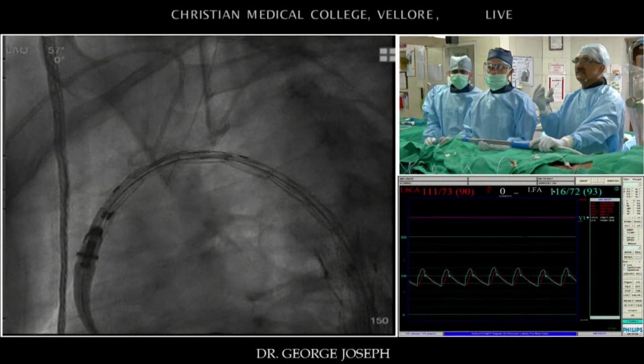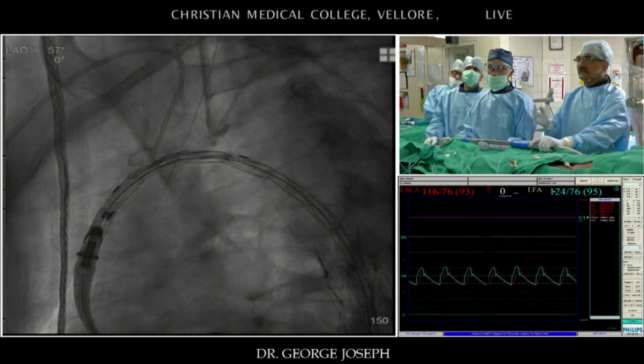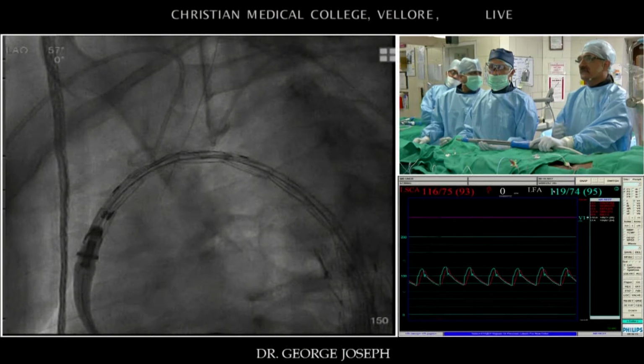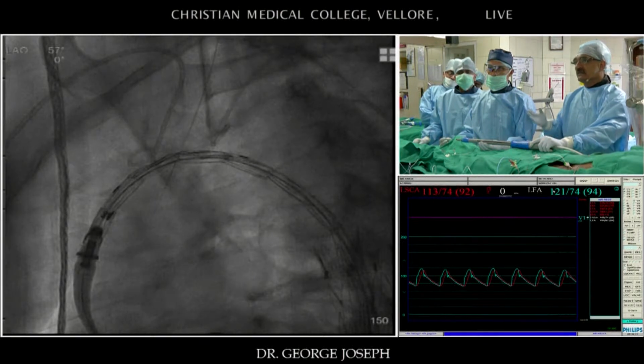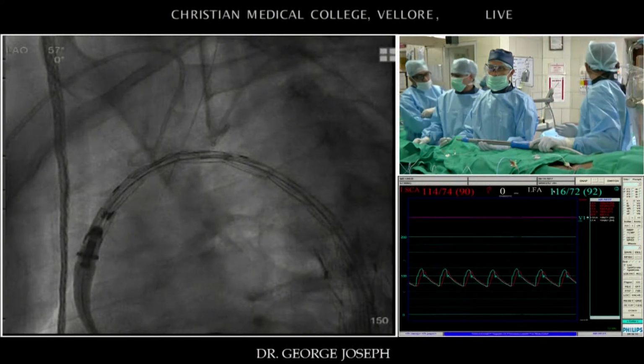But you can't rely on that flap to land your graft and not tear it. If you just look at the entry point and start the graft just above that, there may be a retrograde part of the dissection, and the flap there may give way, and then you will get a new entry point. So you need to start in normal vessel where there is no dissection at all. I don't worry too much about where the entry point is. I worry more about till where the aorta is dissected, and whether I am upstream to that.